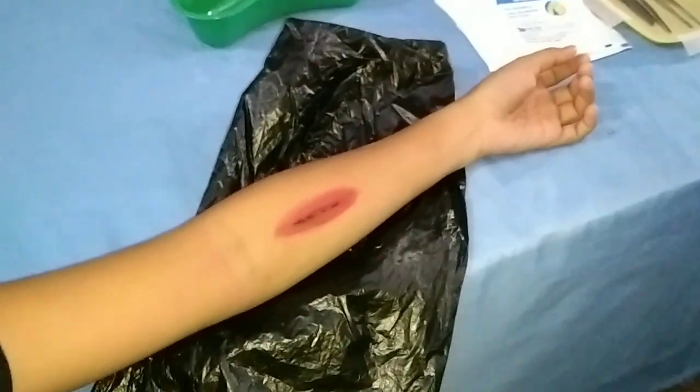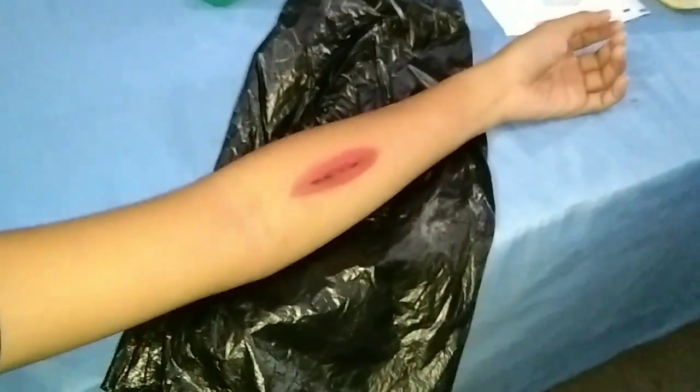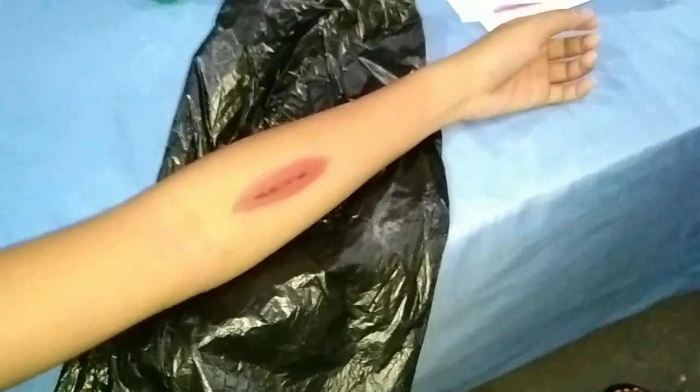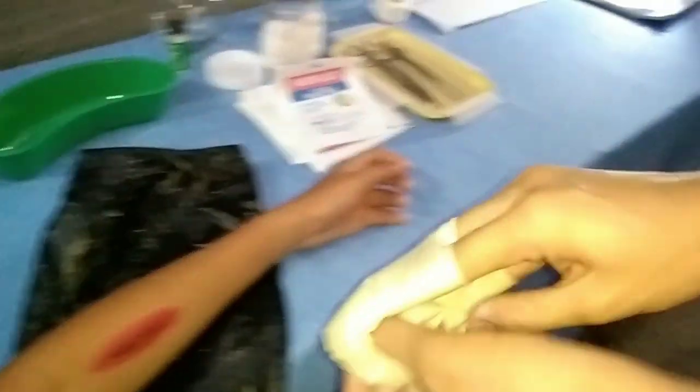Okay, so after that, if a topical antimicrobial ointment or cream is being used to treat the wound, use a swab to remove it. So I have already used the swab and I have already removed it. Okay, and then remove and discard the sterile gloves.